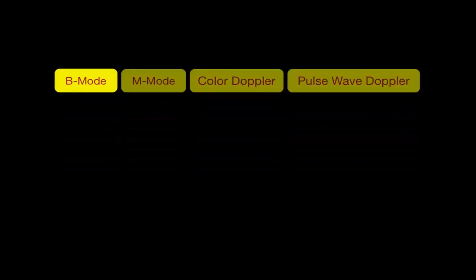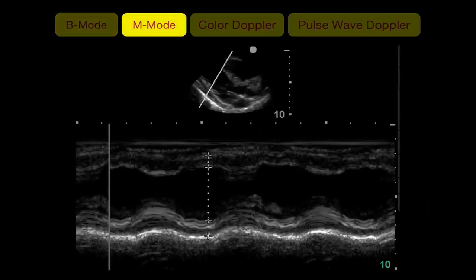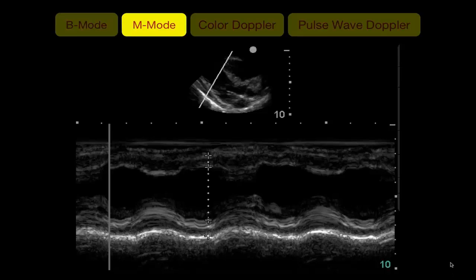Regarding modes of ultrasound: B-mode stands for brightness mode and is used 95% of the time, giving a grayscale image. M-mode stands for motion mode — you start with B-mode with a line, and activating M-mode gives an image with a vertical axis displaying depth and structures, and a horizontal axis displaying time. You can see the motion of any structure passing through that line. M-mode has good temporal resolution, meaning it accurately displays highly moving objects like the fetal heart or myocardium.